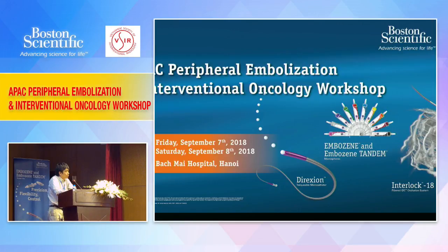AVM is a complex disease. What we are treating is what we can see. In the long term, some will come back. But if it comes back and doesn't give you trouble, it's always better to live with some imperfect result rather than a perfect embolization. We can always take it off by removing the whole segment of the kidney. But I would see if whatever is left over is minimal, and follow up after 3 months or 6 months on a CT angio, it doesn't really show much recanalization, and the patient is very well, no signs of bleeding.